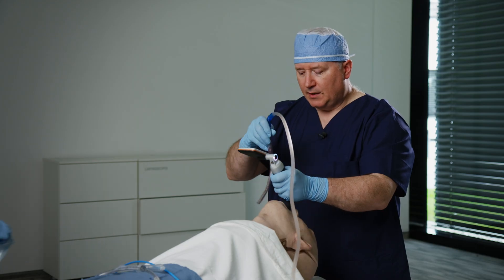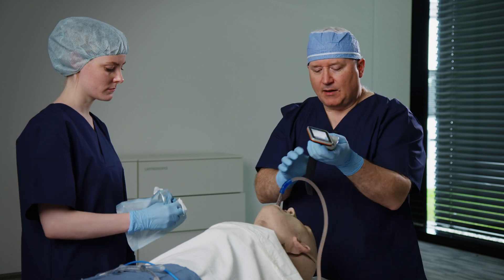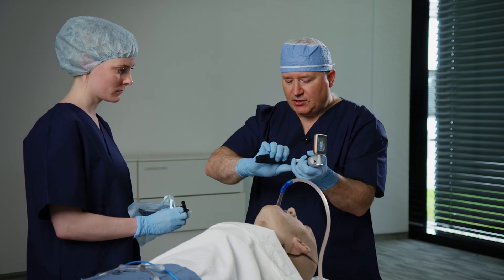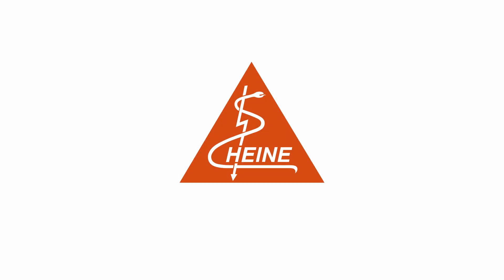I'll ask my assistant to come forward — I'm going to leave the suction in the patient while I do this — and we're going to rapidly change out our blades. Very nice. And now I'm back in business.